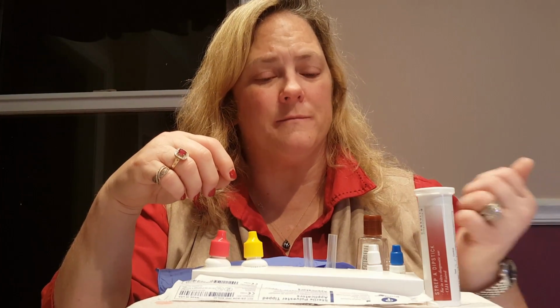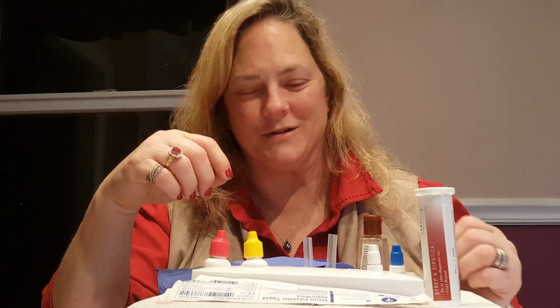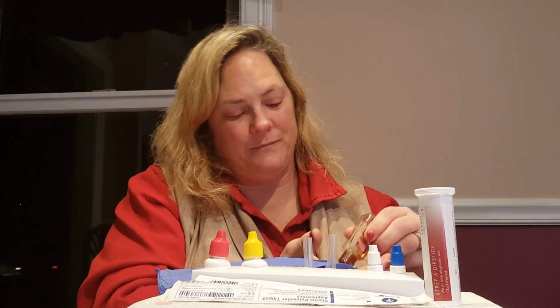So today we will perform the testing, and I have a guest who will kindly subject themselves to a strep test with me. I'm going to do hand hygiene, and then I'm going to apply gloves.